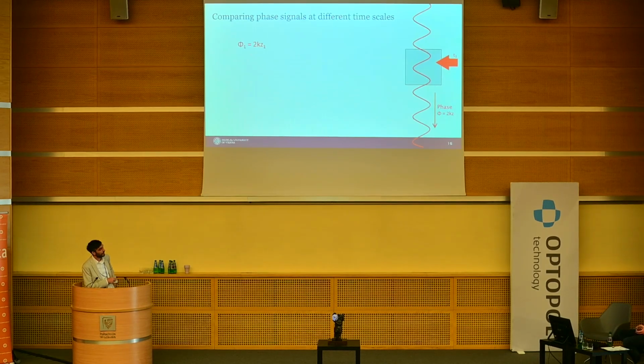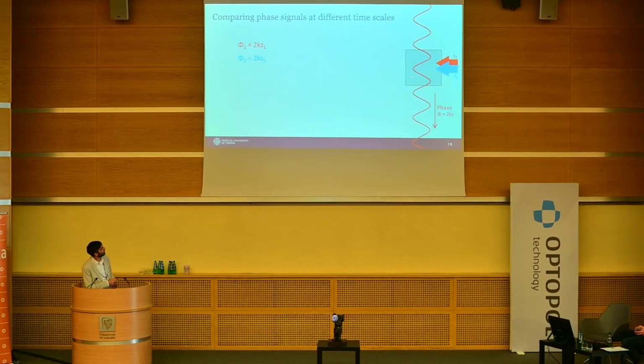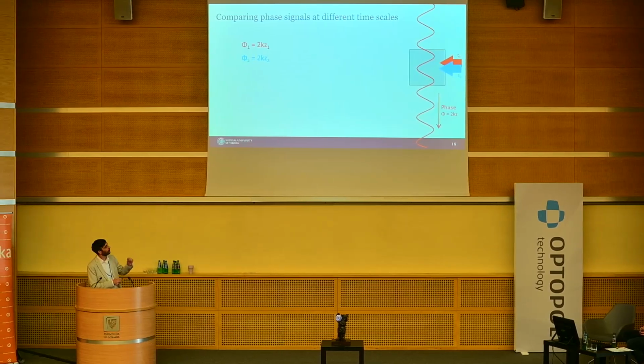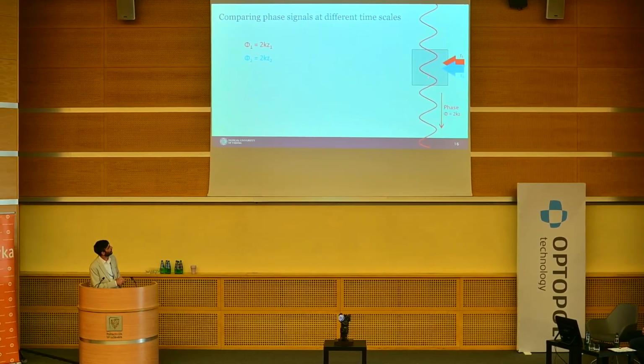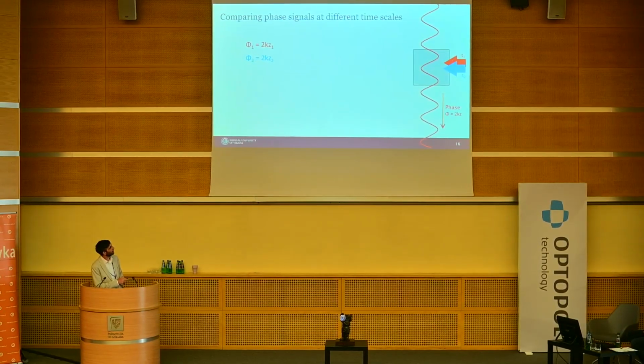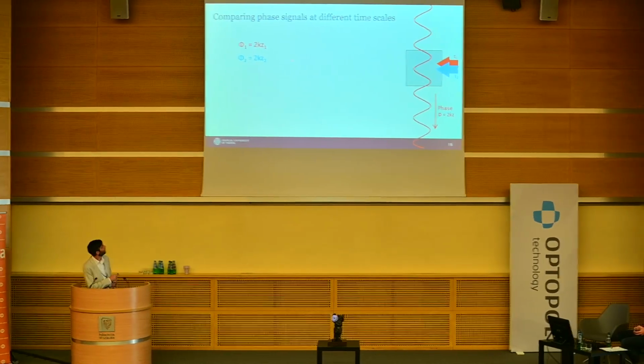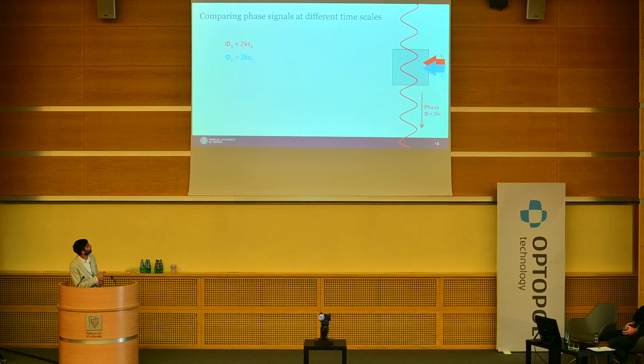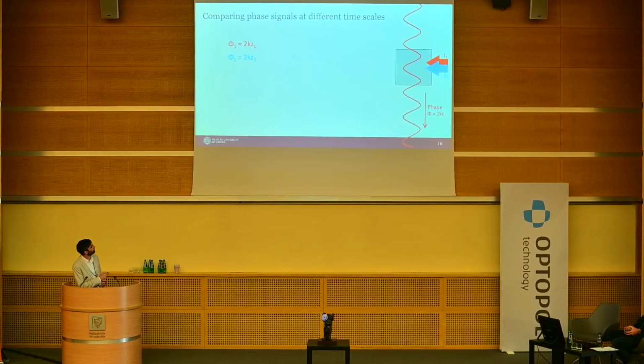At this position. If at a slightly later time point, a structure that's producing the backscattering signal here has moved, let's assume a red blood cell, for example, has slightly moved here by a fraction of a micron, a fraction of a wavelength, it will produce a phase corresponding to 2 times k, the same wave number here, times Z2.